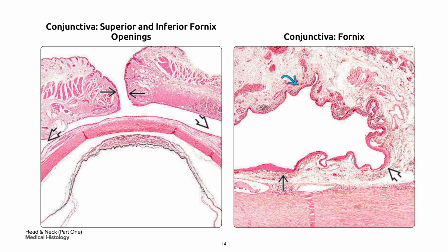On your right is the palpebral conjunctiva in the curved blue arrow and the bulbar conjunctiva in the single black arrow that are meeting in the fornix in the bold black arrow. It is in this region that the lymphoid aggregates and abundant epithelial goblet cells can be identified.